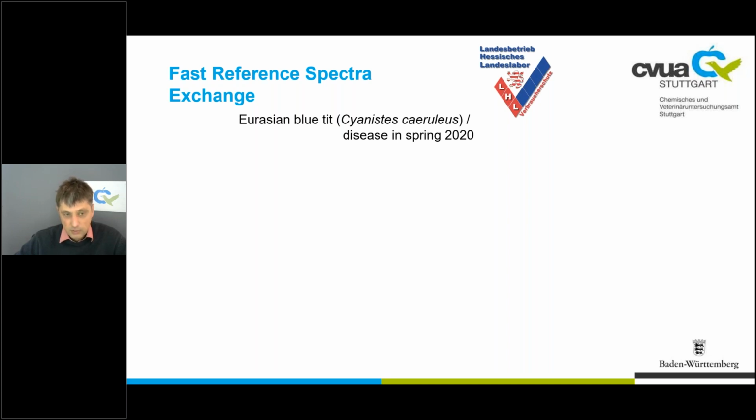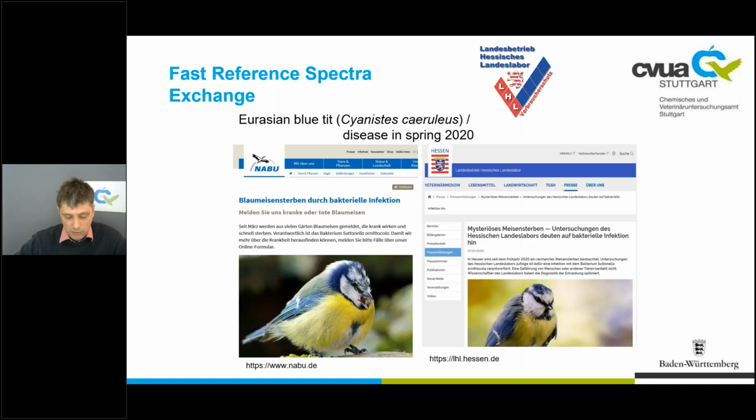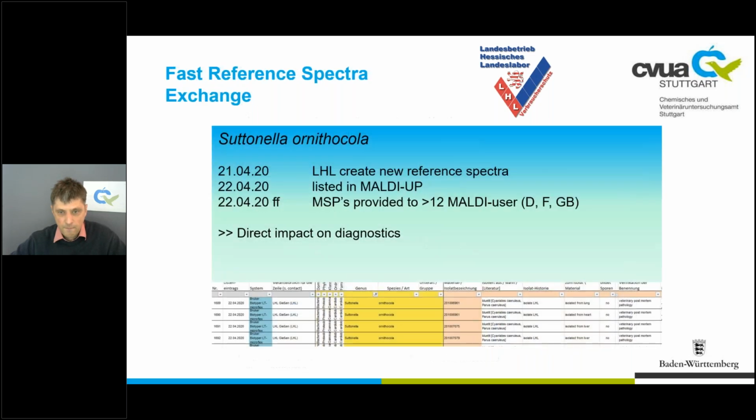Last year, 2020, we observed a disease of blue tits in Germany. A few days after isolation of the first suspicious bacteria, the colleagues in Gießen created some reference spectra for MALDI-TOF mass spectrometry.